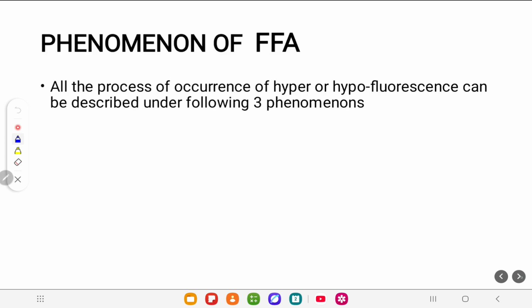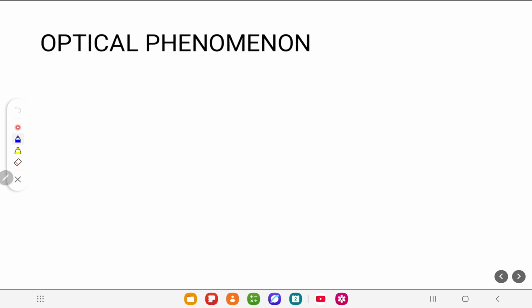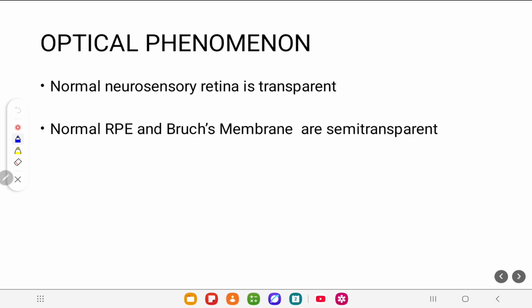Now let me come to the main topic, that is the phenomena of FFA. All the processes of hypofluorescence or hyperfluorescence can be described in three phenomena: optical phenomenon, mechanical phenomenon, and dynamic phenomenon. So hypofluorescence and hyperfluorescence can be explained in these three terms. Okay, three phenomena. Let me describe first the optical phenomenon.